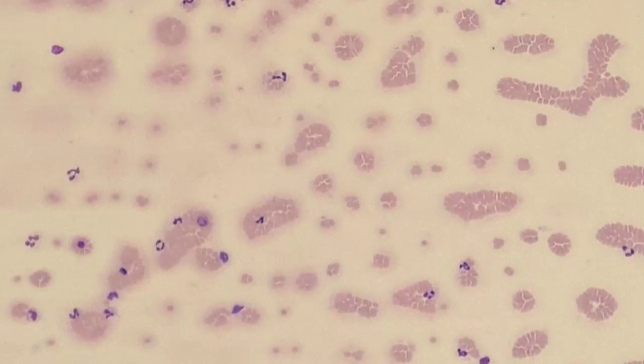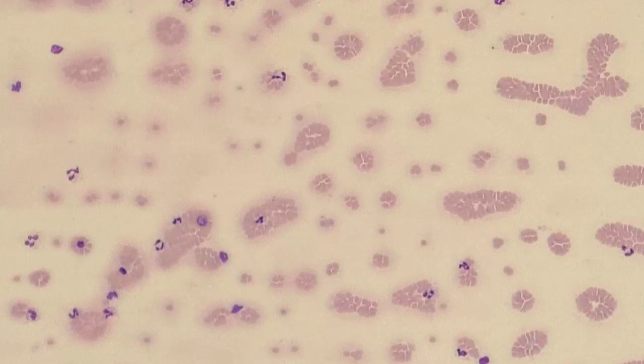Another thing that might turn up here are blasts. If you recall, in the bone marrow, you have stem cells, and after a stem cell, the next stage that we see are blasts, whether those be myeloblasts or lymphoblasts or erythroblasts or pronormoblasts.